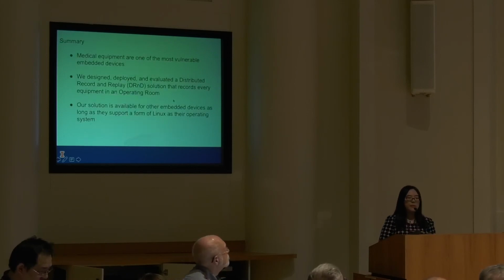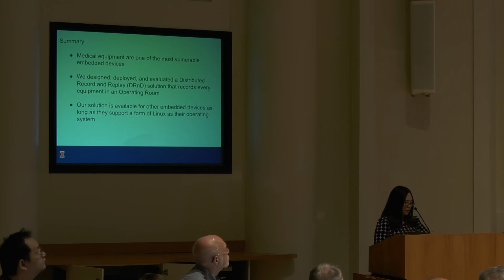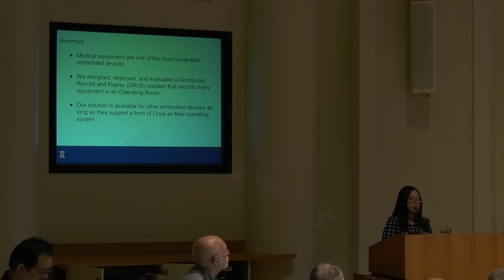To sum up, medical equipment are among the most vulnerable embedded devices, and in this project, we designed, deployed, and evaluated a distributed record and replay solution that records every piece of equipment in an operating room. Our solution is available for other embedded devices as long as they support a form of Linux as their operating system.